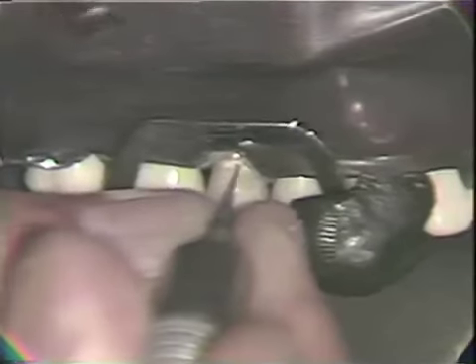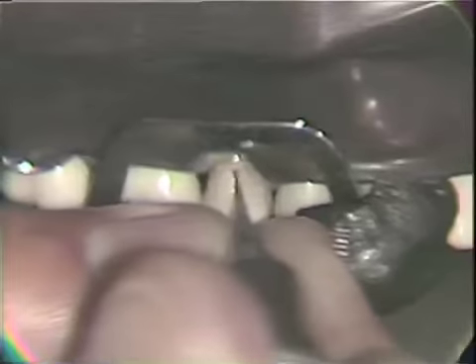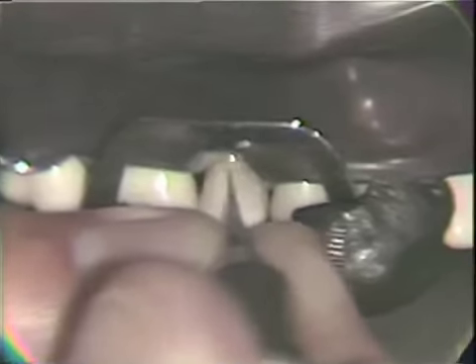Again, here we're into enamel. We want that side of the burr to be at such a position so that we will parallel enamel rod direction.